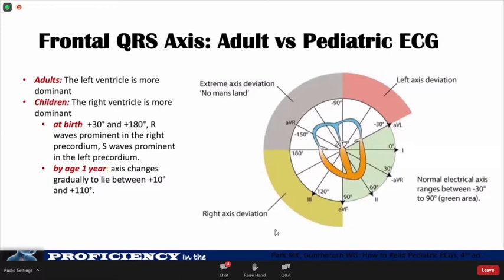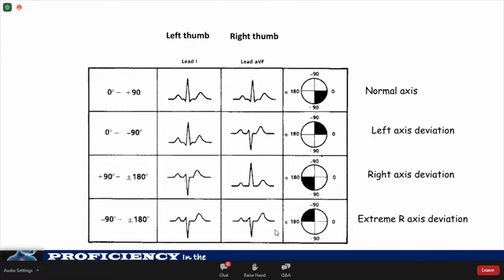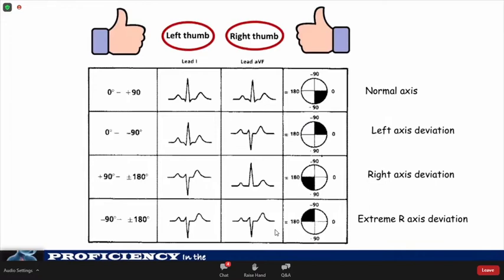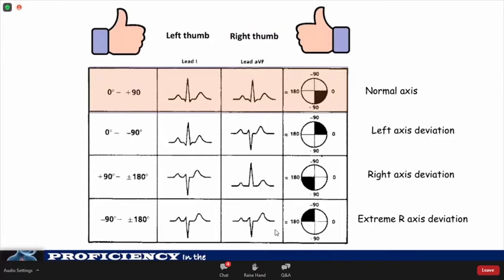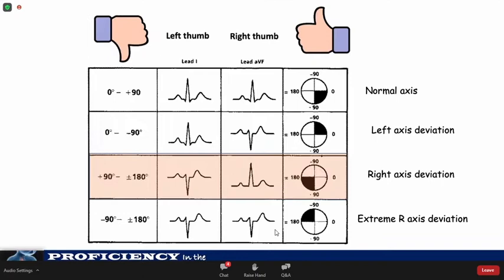Like any other parameter, normal ranges of QRS axis vary with age. The most convenient way to determine the QRS axis is the rule of thumb. We look at the QRS complexes of lead 1 and lead AVF and use our left thumb and right thumb to represent deflections of each lead respectively. If both lead 1 and AVF are positive, you get two thumbs up, meaning the axis is normal. If the QRS in lead 1 is positive but negative in AVF, you have your left thumb up, meaning there is left axis deviation. If AVF is positive and lead 1 is negative, you have your right thumb up, indicating right axis deviation.